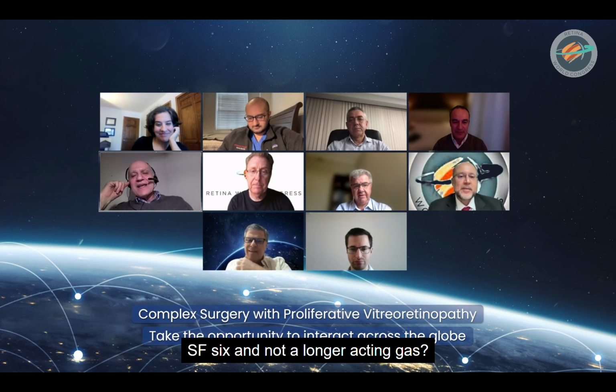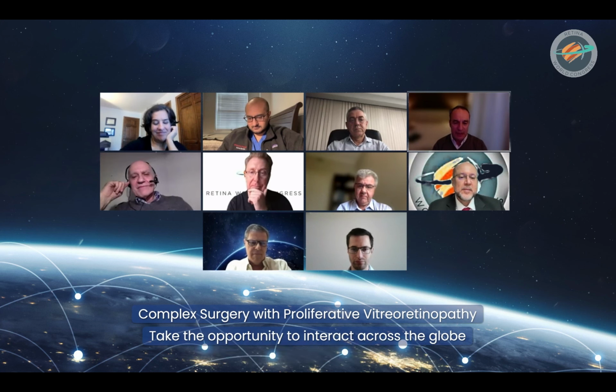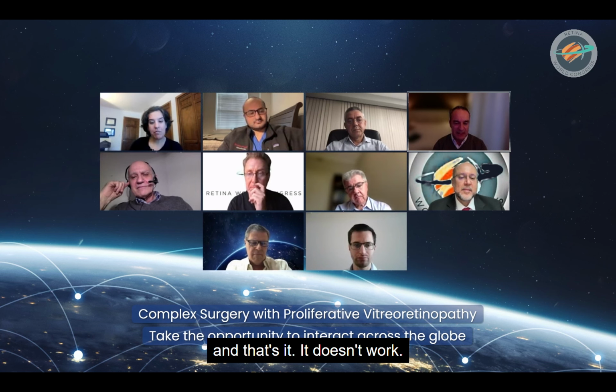Stratos, why SF6 and not a longer acting gas? We don't need longer acting gas. I mean, maybe only air could be enough. Just SF6, 10 days of a nice big bubble, it's enough. And posturing for 5 to 6 days, and that's it.